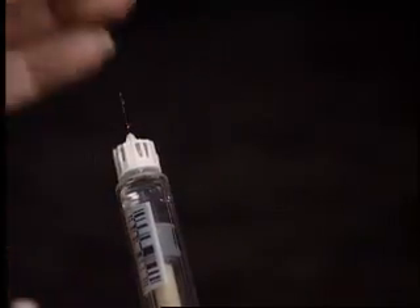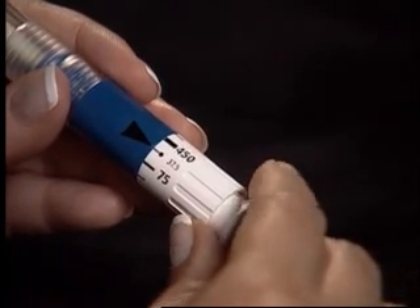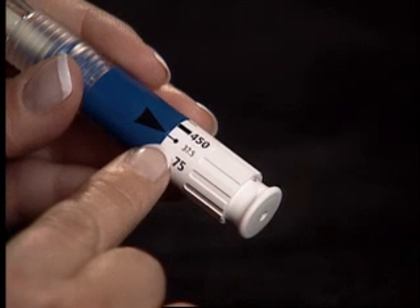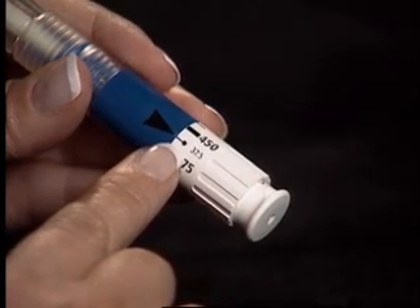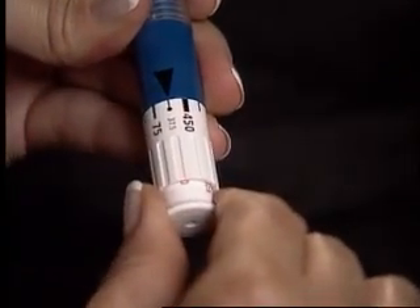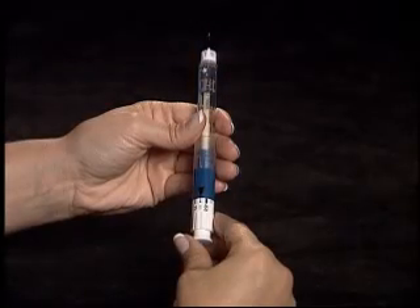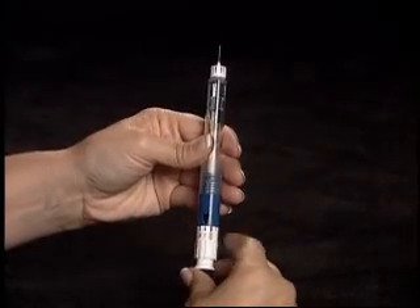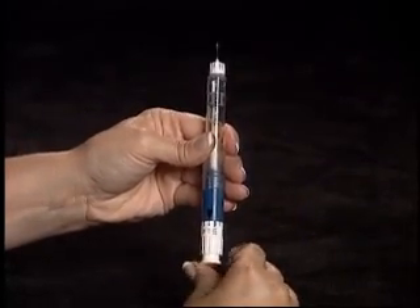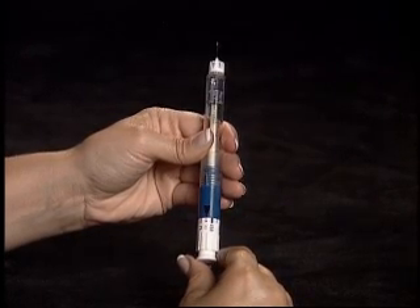Carefully remove the inner needle cap. Prior to the first use of each pen, turn the dosage dial to 37.5 international units, making sure that the dose is lined up with the black arrow. Pull out the injection button as far as it will go. Point the needle upwards and tap the pen to force any bubbles to the top, then press the injection button. A click may be heard and a small amount of liquid should appear at the tip of the needle. Now the Gonal F Pen is primed.